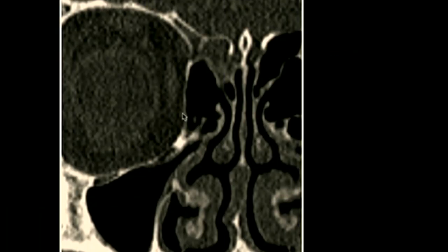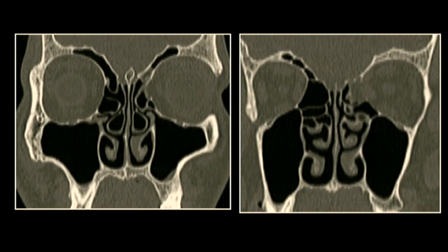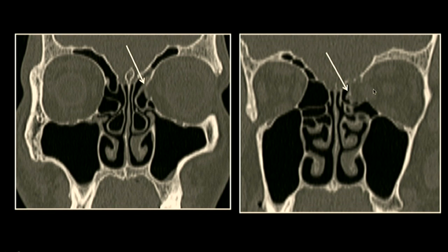The lamina papyracea, the medial wall of the orbit, should run in the plane of the maxillary ostium. If it is more medial, it will be more prone to injury when the surgeon introduces the endoscope to remove ethmoidal inflammation. The lamina papyracea may also have defects, normally seen in about 10% of the population — smaller defects are very common. However, defects become more significant posteriorly, where there is less fat between the medial rectus and the medial orbital wall, increasing the risk of orbital injury. So it is not only the size but also the position of the defect that matters.